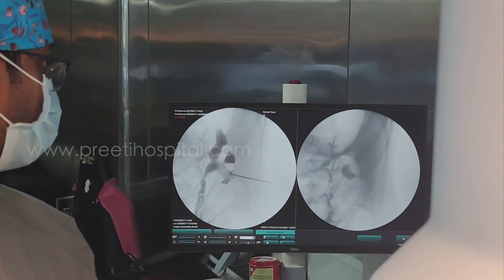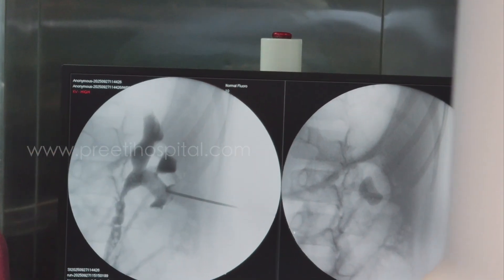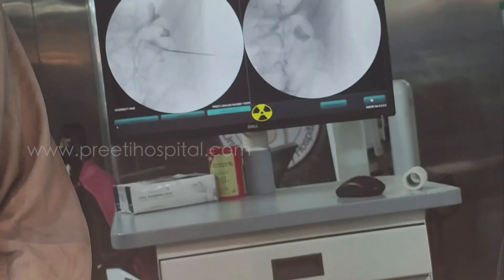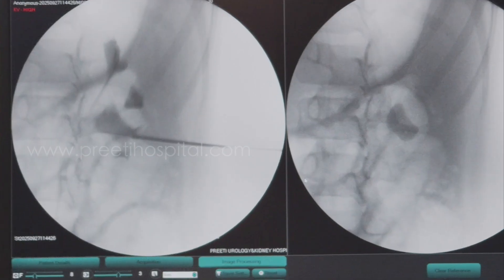If I had to go to the upper calyx, I would have gone to its lateral part. Lateral part — inject saline slowly, you pass through. It has gone in. So I am safe. That's all.